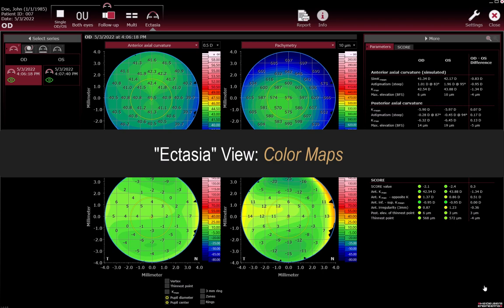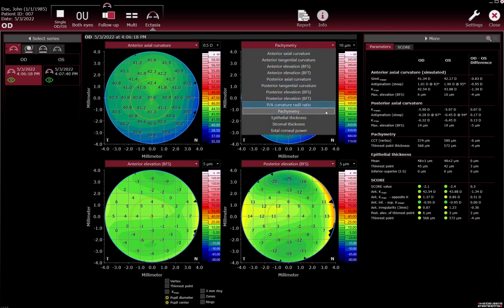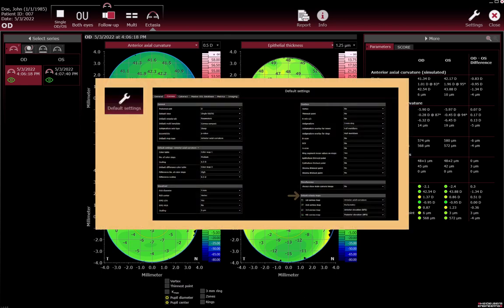Ectasia view colour maps. In the colour maps section, review the colour maps. The colour maps available by default are the ones considered most helpful in assessing ectatic changes. If you want to use another colour map for analysis, select it from the drop-down list above the colour map. You can change the default set of colour maps displayed when you open the Ectasia view by changing the default Ectasia map setting in the default settings.